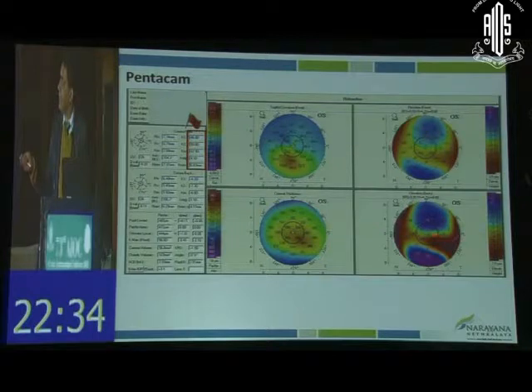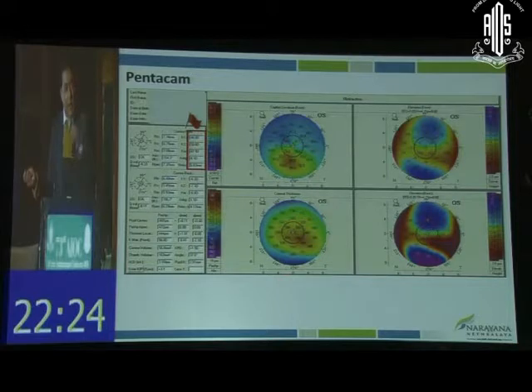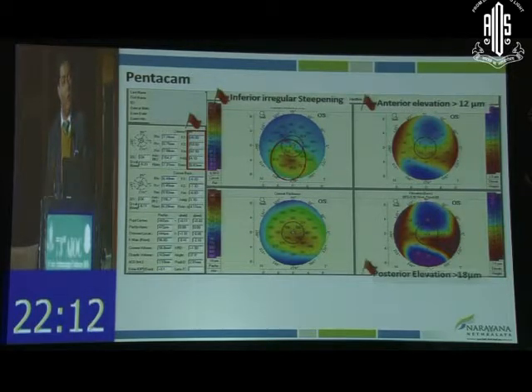When you see red, blue is always minus, and anything in plus means it's higher. So if you look at the blue area, that means this area is lower. It's at sea level compared to this area. This is like a mountain. So that is how you look at a scan. When you actually see a scan, it will be self-explanatory, because you can read any scan, because that's all we look at, and then try to correlate this area with the pachymetry changes.